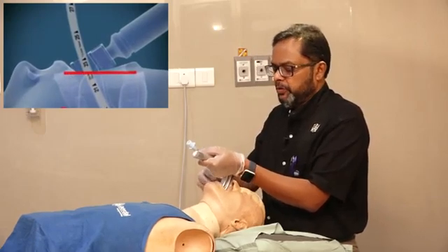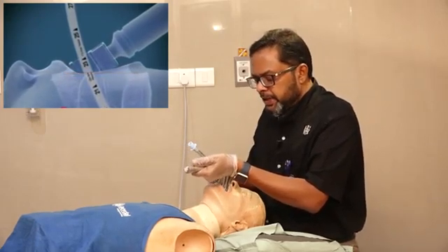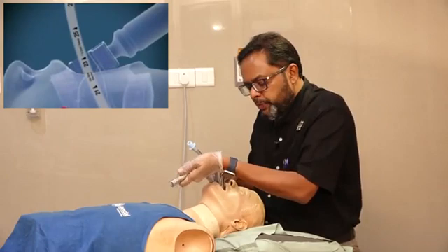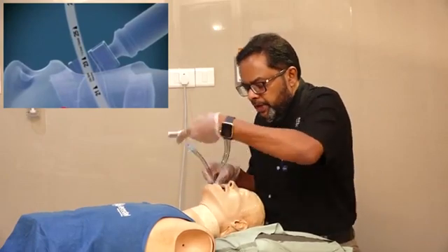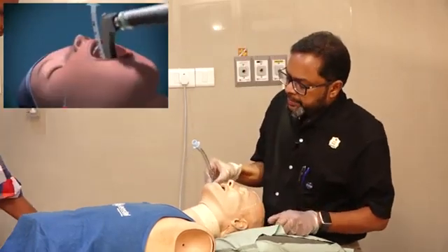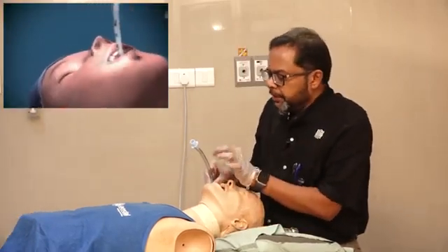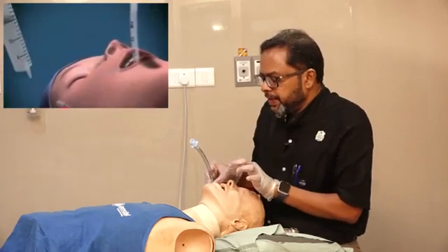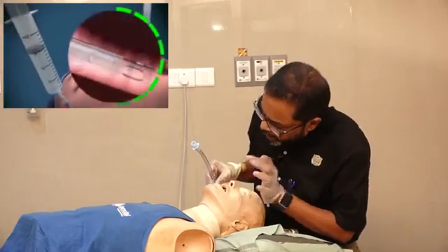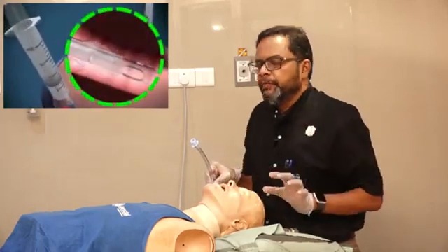Once intubation is complete, remove the laryngoscope, then hold the endotracheal tube against the lip, note the lip marking number, and secure it in place.